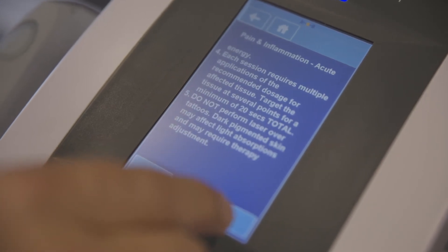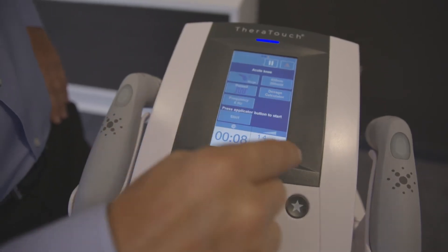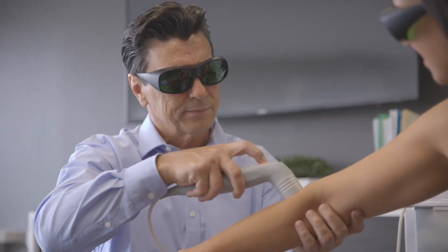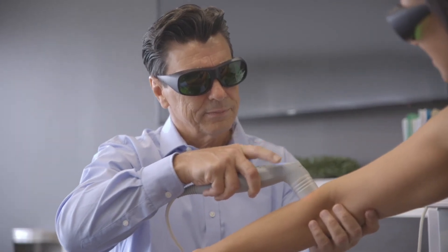Theratouch LX2 comes loaded with evidence-based protocols, allowing you to simply select an indication to load clinically proven treatment parameters, eliminating the time to set up individual parameters for common conditions.